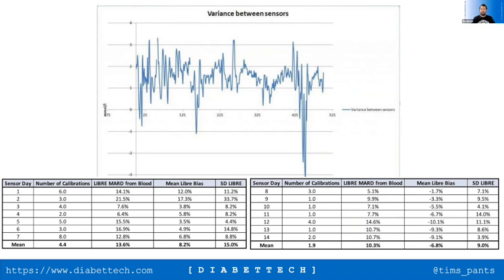That's a CGM that's being used with, or likely to be used with, a number of commercial systems. So there's no way it's 10 to 15 minutes behind on that reading. Take that statement with a pinch of salt. It's really about the same as the G6 is. Reps will say it's 5 minutes. Libre 1, it's 4 to 6 minutes, and that's what the data suggests in the testing that has been done.